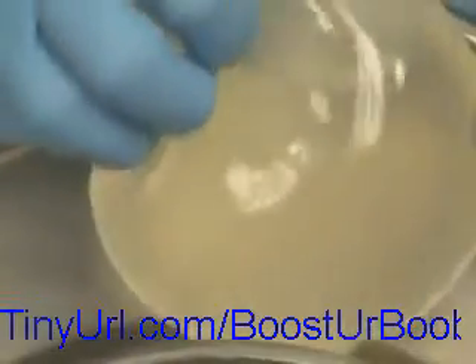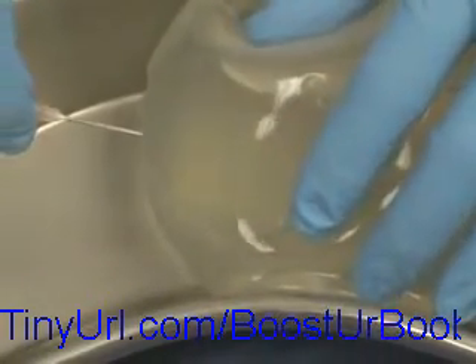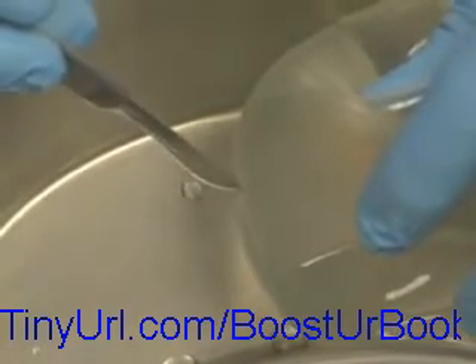Here is our saline implant. We'll put a needle into it. This kind of failure occurs two percent over seven years and three percent over ten years. You can see a few drips of water here. When deflation occurs, it doesn't happen rapidly — it occurs over a period of days and weeks, but ultimately all the saline comes out. That can't be repaired.